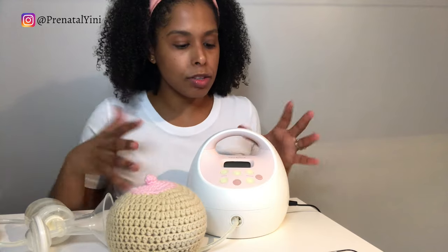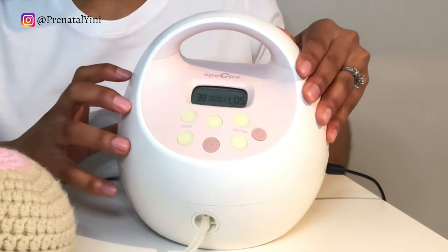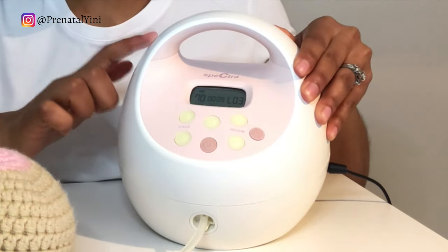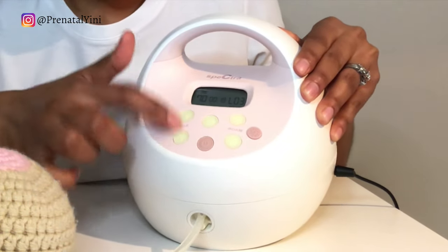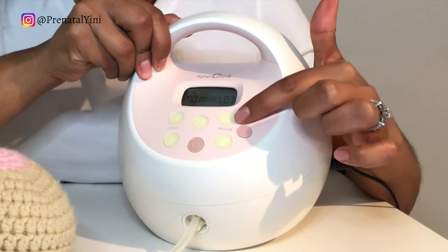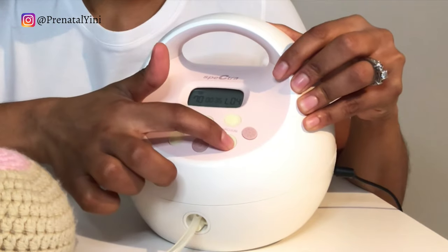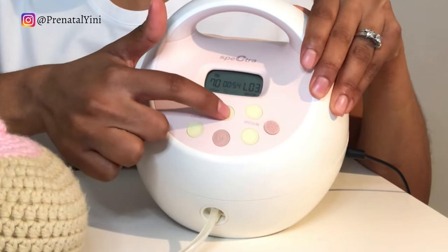To start pumping, turn on the machine and press the three-line button to enter massage stimulation mode. This mode has a faster, fixed cycle that you cannot change on the Spectra S1 or S2. What you can change is the vacuum level — start at level 3, and if it's not painful you can increase to level 4 or 5. Stay in this mode for about two minutes or until milk starts flowing.